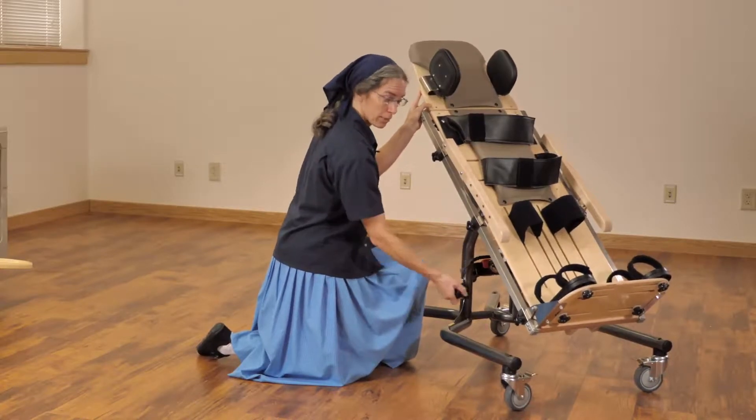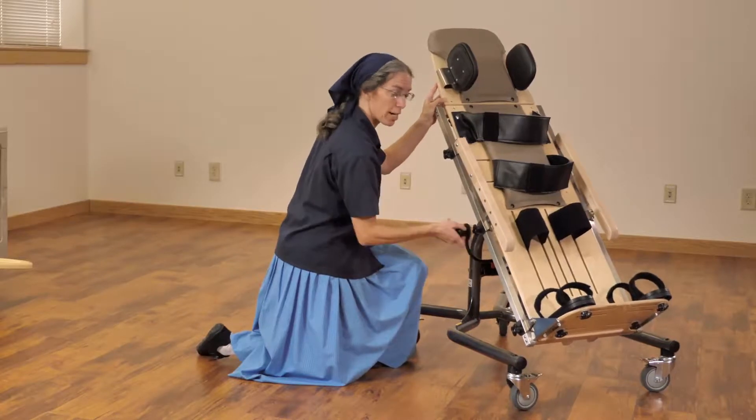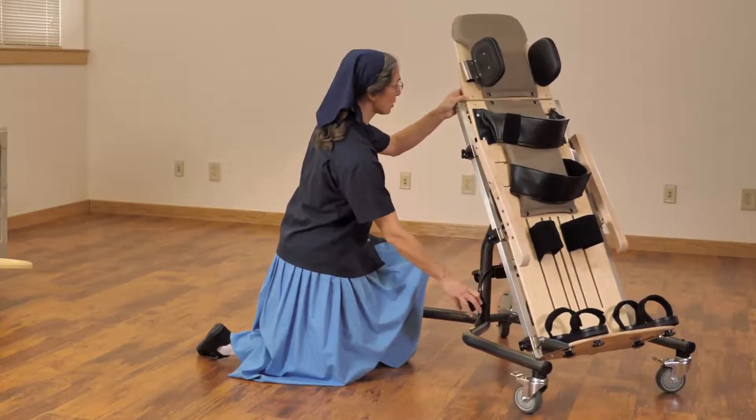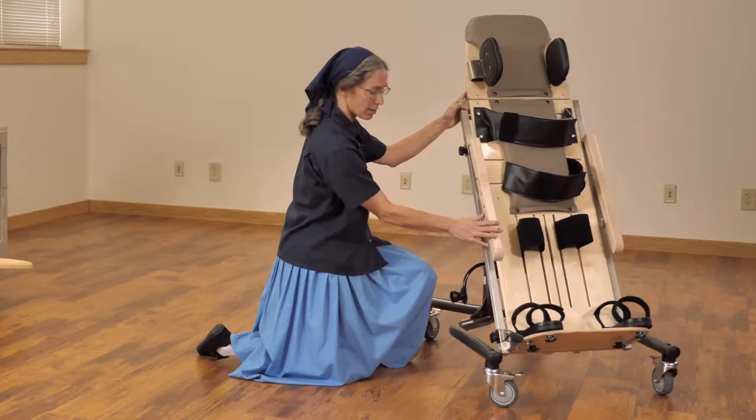Remember, many of these medically fragile children have low bone mineral density. You'll want to position carefully to avoid the risk of fracture. We have great accessory support: head, trunk, knee, and sandals.